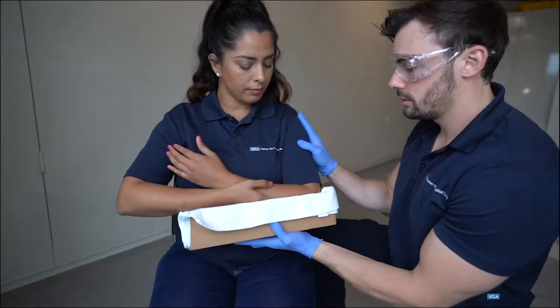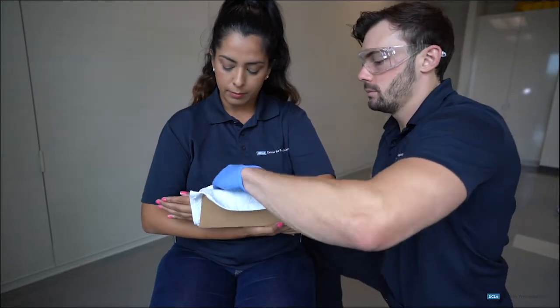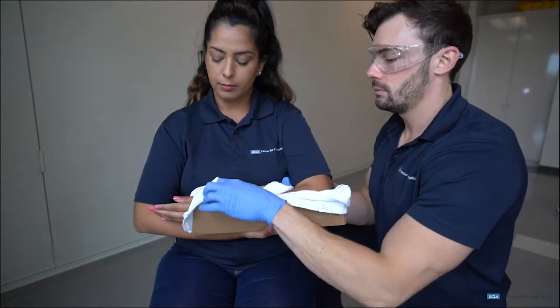The EMT then properly applies the splint, securing the long bone above and below the injured joint while eliminating excessive movement.